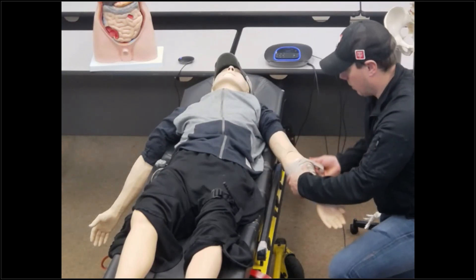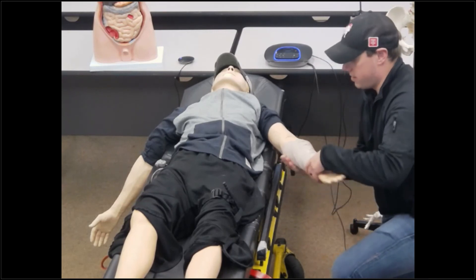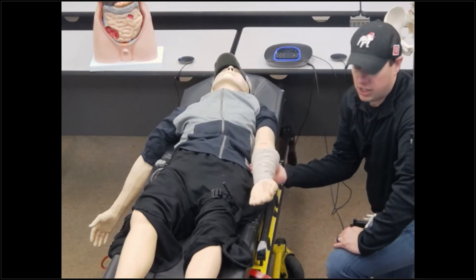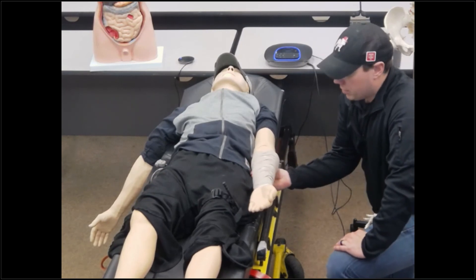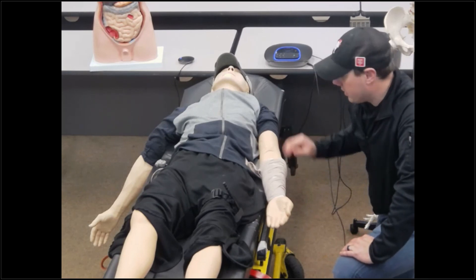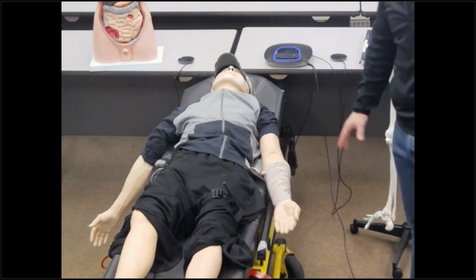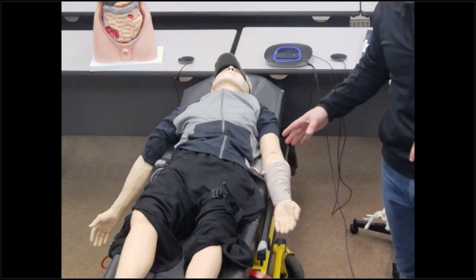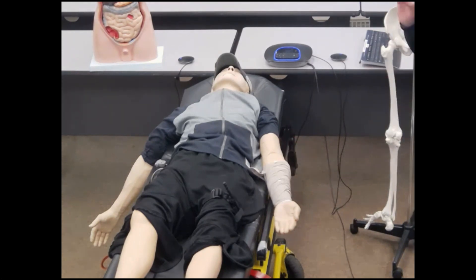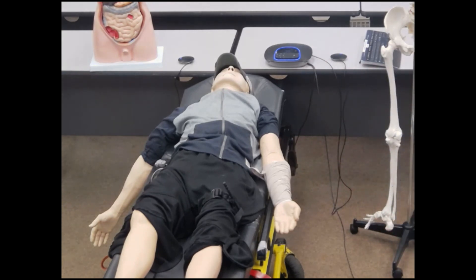Now I've got pressure and that skin is starting to tent together. Once I get to the end of that ACE bandage, go ahead and secure it. Re-check your CMS and make sure you're not bleeding through. If you're bleeding through on something like this, you might have to go ahead and apply a tourniquet. That does it for a couple of examples using pressure dressings — it's not just the arms you can use this for, but lower extremities as well. Both of those applications work very nicely. Thanks, everybody.